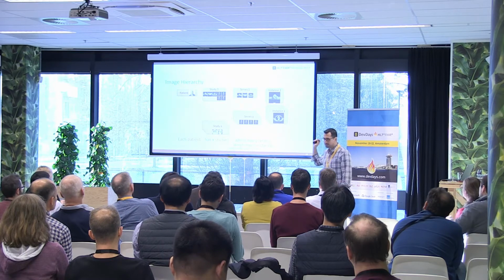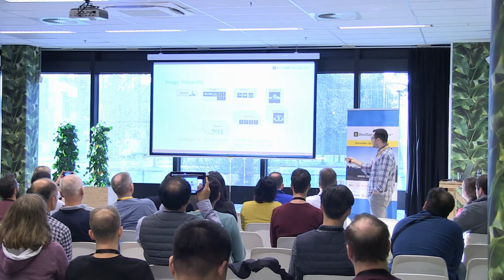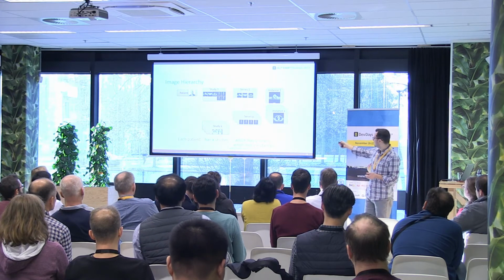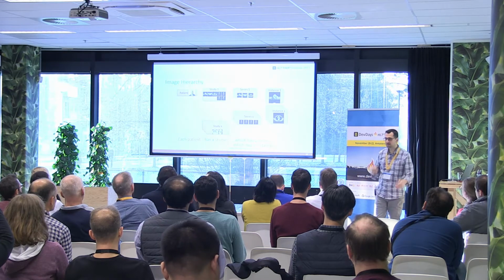Within a series, you have instances. Why do you have the hierarchy? Well, the patient part is pretty obvious. The study part is the next obvious thing. So, maybe today you broke your hand or you're having a symptom, so they order a study for you. Within the study are different series. Series could be different things.